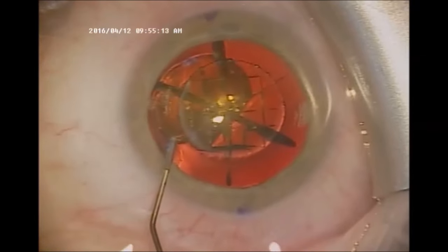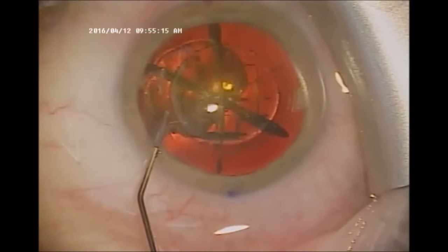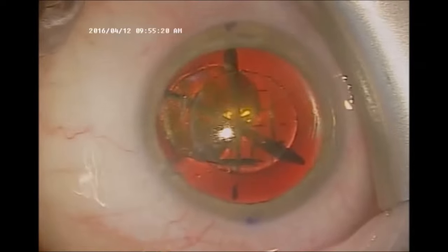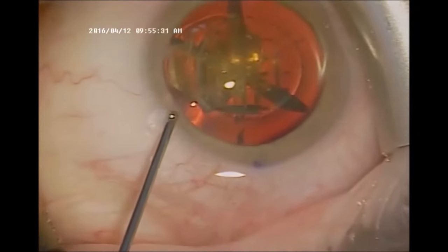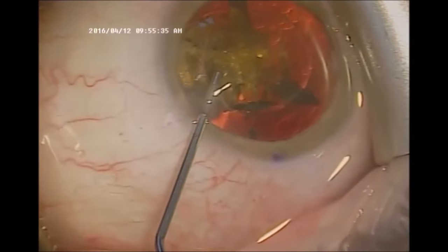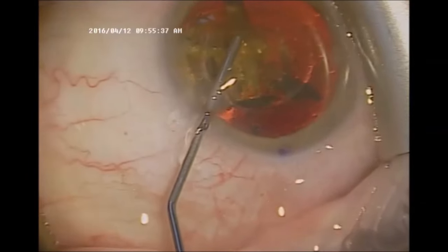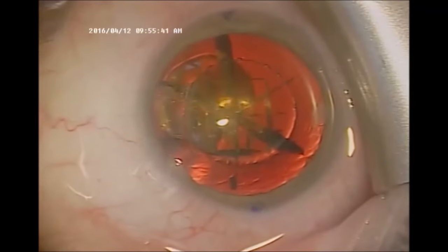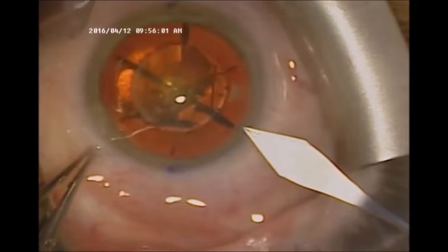Here we inject numbing medication or preservative-free lidocaine into the eye in order to keep the eye dilated as well as to keep the patient comfortable. Here is Viscoelastic in order to keep the eye formed during the remainder of the procedure. The patient may experience a kaleidoscope of colors at this point.